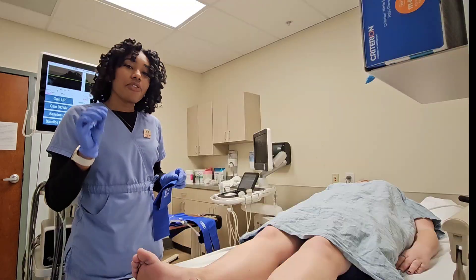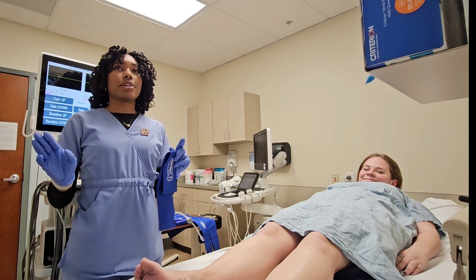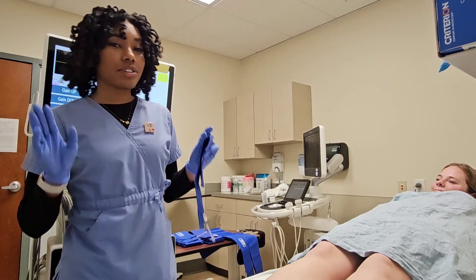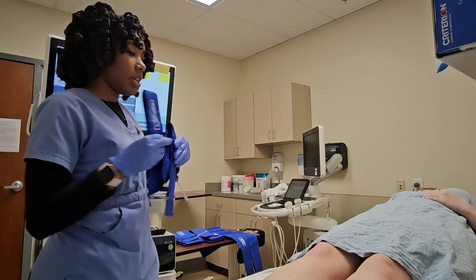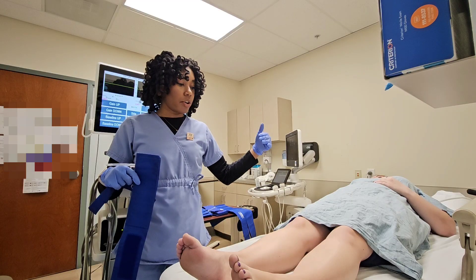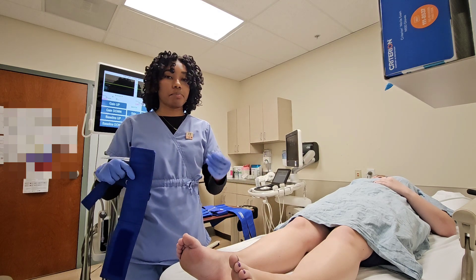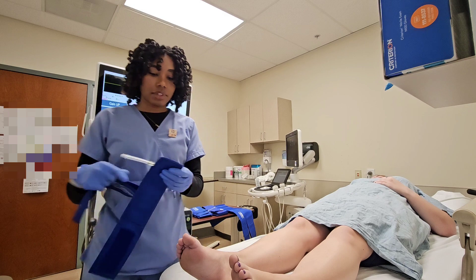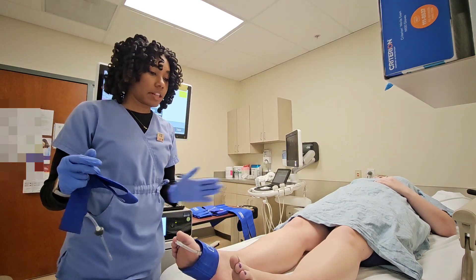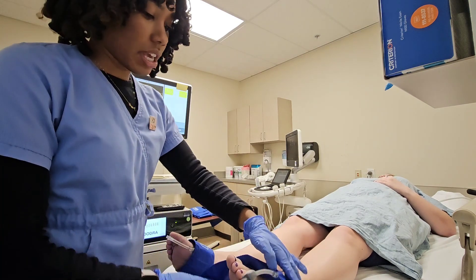Doing these exams, you find out how little people like to follow directions. These exams are supposed to help test the arterial blood flow going down towards the feet — do the feet have enough blood flow going to them? Some people with gangrene, pain in their feet or legs, rest pain, or claudication will have this type of exam performed.